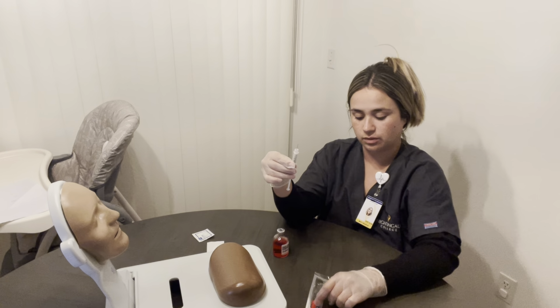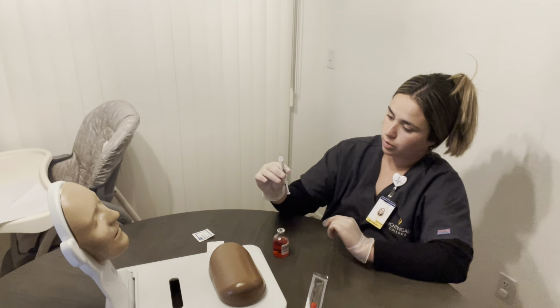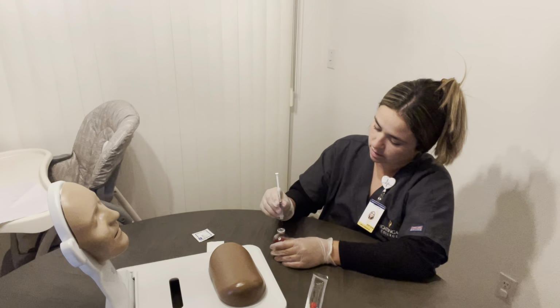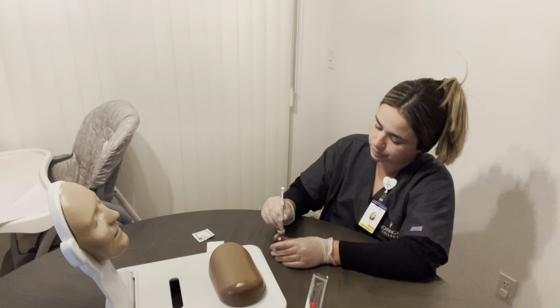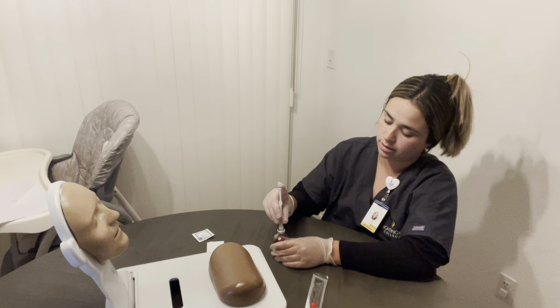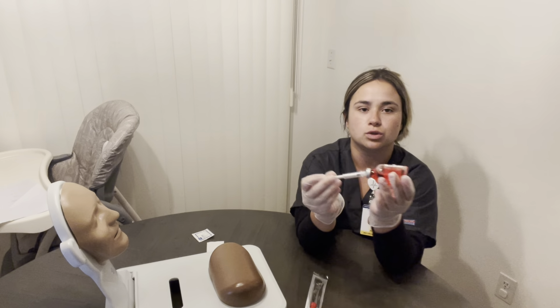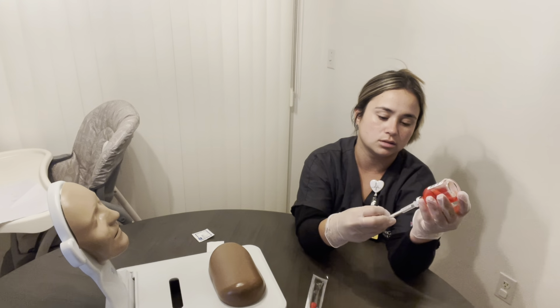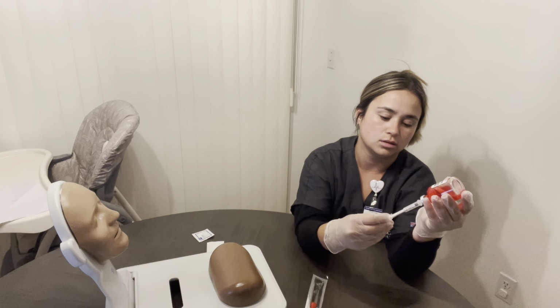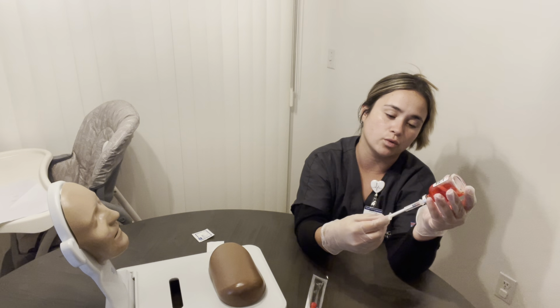And I'm going to place it right here just so that I can be able to go back and get it. So now I'm going to inject the needle into the medication. Okay, now I will push the air in there. Okay. Now we will draw up the medication. Again, making sure to draw up the correct amount for the order.